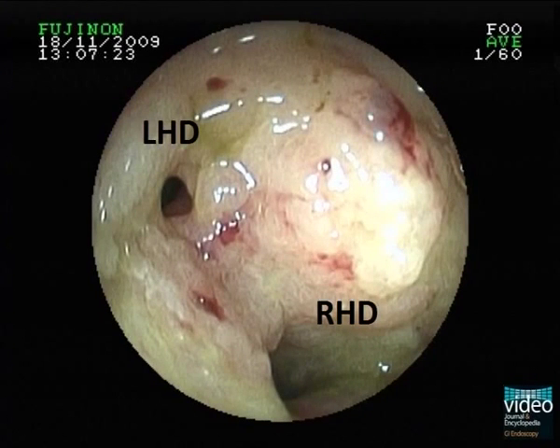Here we see significant obstruction of the left and right hepatic duct at the confluence.